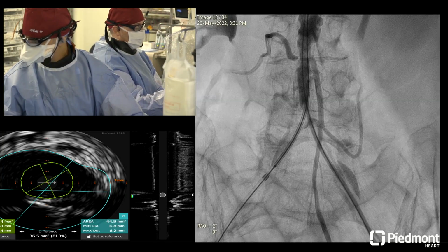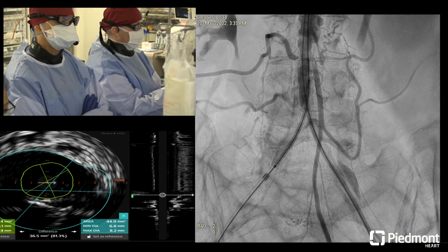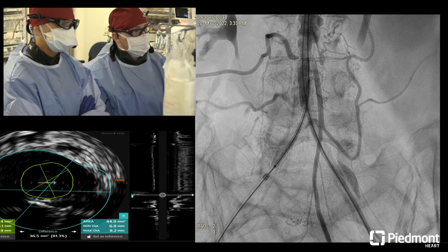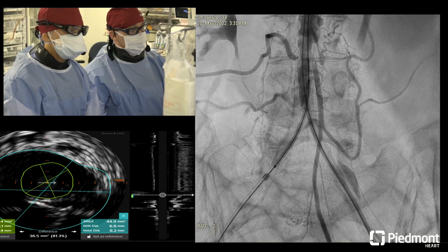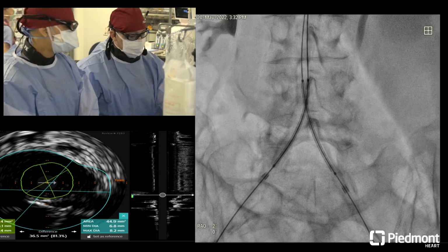So I just want to make sure that we're cool in the same area here. So again, if you see where that is, and I like using non-DSA here so I can really see exactly where we're at. I mean, I kind of like that. We're below the IMA. We've got those lumbars. I like the distance into there, and I think we're equal. You guys happy with that? Because I am. Yep. Looks good.